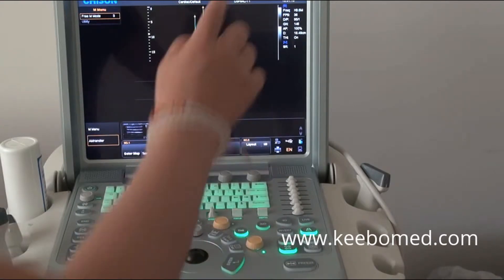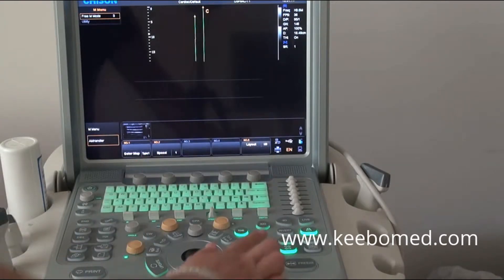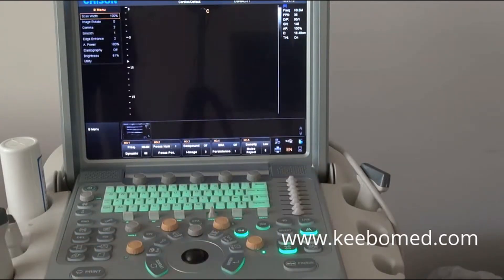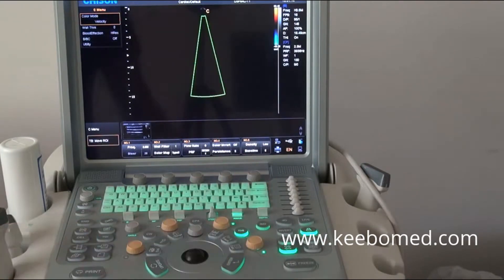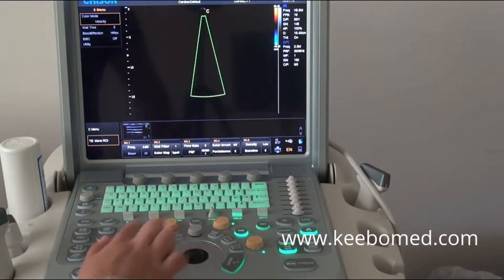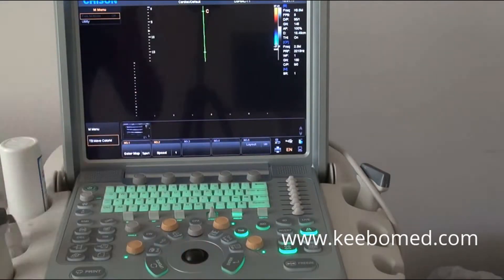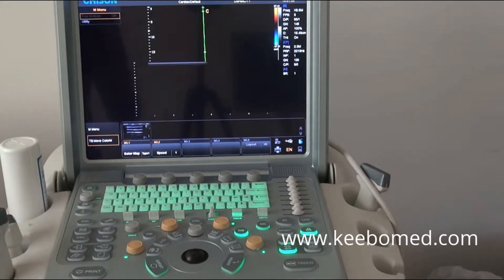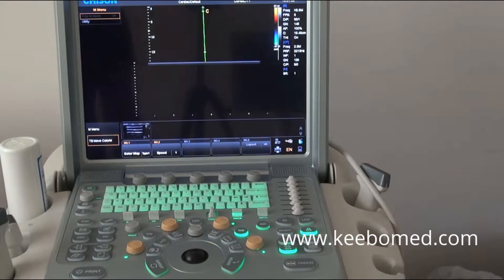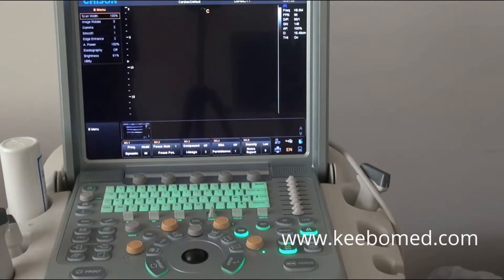Press the enter key to fix it. After that, go back to B mode. Press the C key to go into C mode, and press the M key to go into the color M mode. You will find the color and the M wave can be displayed on the screen at the same time.